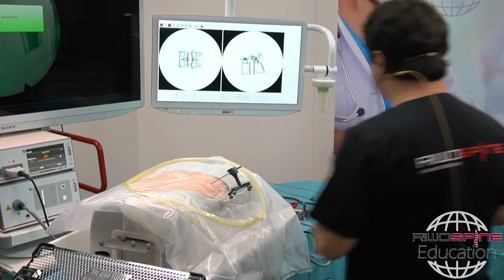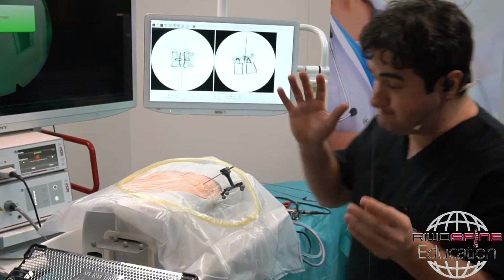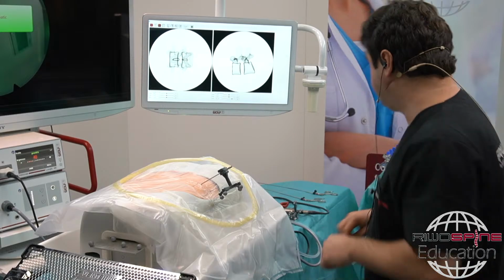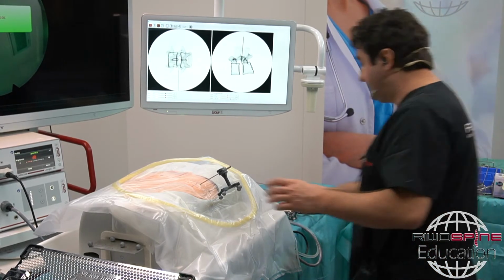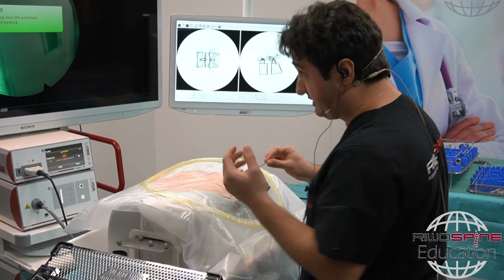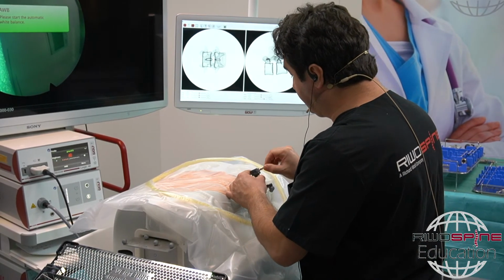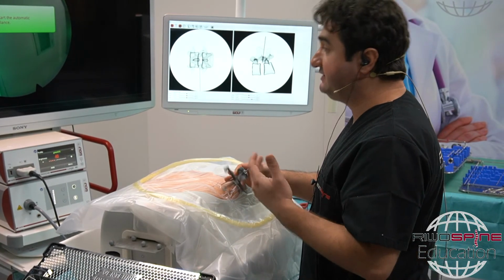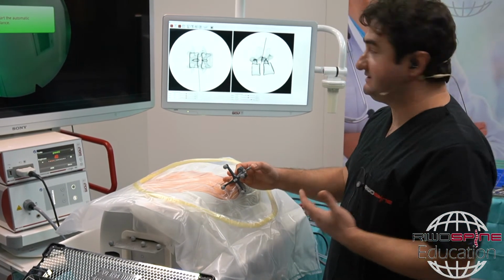If the question is approaching extraforaminal herniations, not the stenosis, then we have two options. We have to check the preoperative images. First of all, we have to evaluate where the exiting nerve root is, and also whether we have enough space at the caudal side.